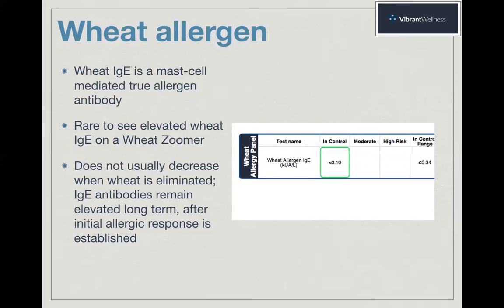Wheat allergen IgE does not usually decrease when wheat is eliminated. IgE antibodies remain elevated long-term after initial allergic response is established.